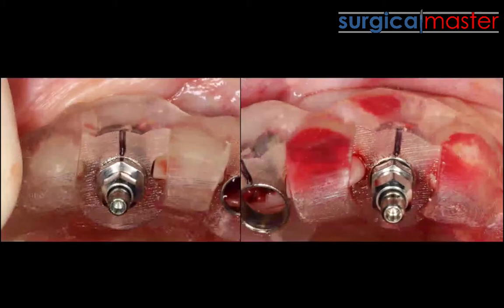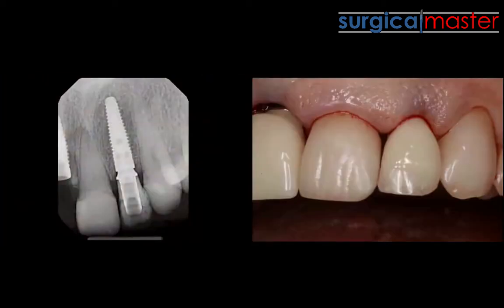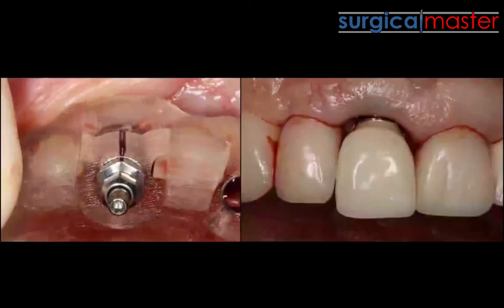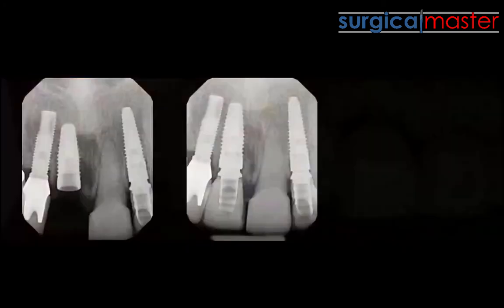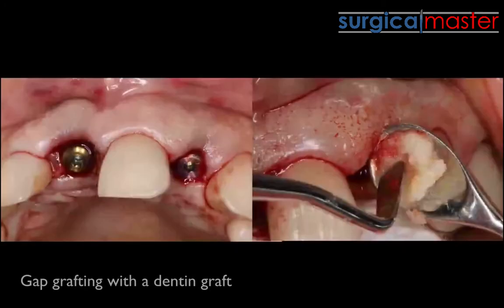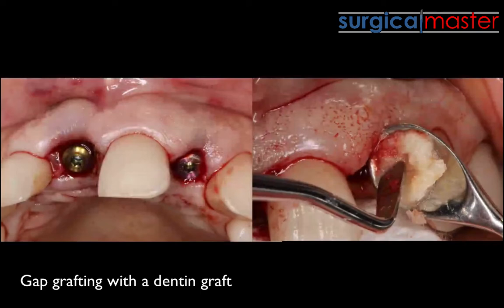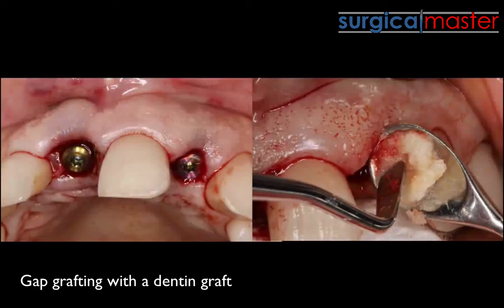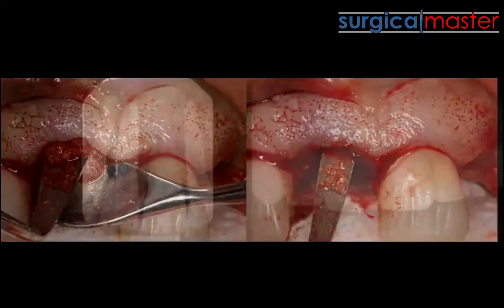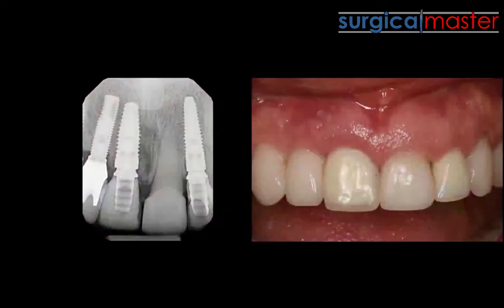Here are some verification x-rays, and the implants are delivered fully guided into the osteotomy sites. Make sure you seat them fully into the final position. Here's the dentin graft used for gap grafting. Provisionals are made and delivered, resulting in a really happy patient.